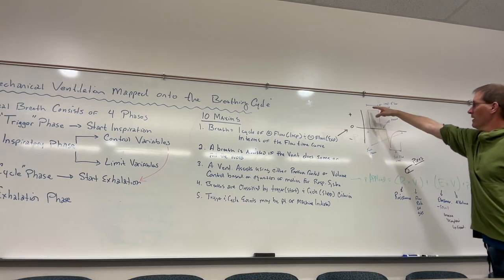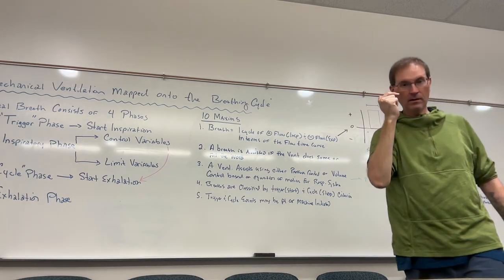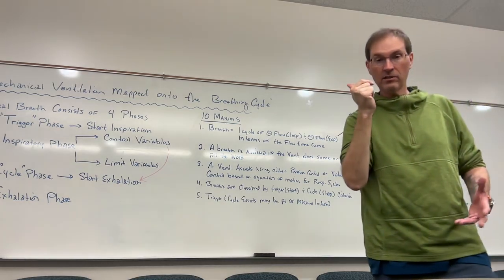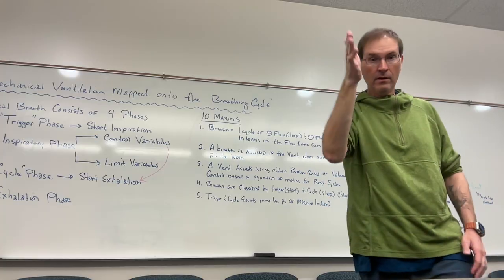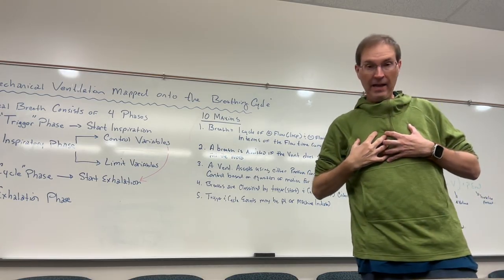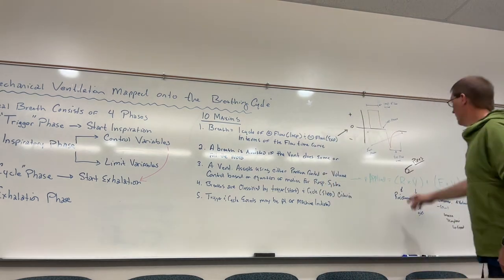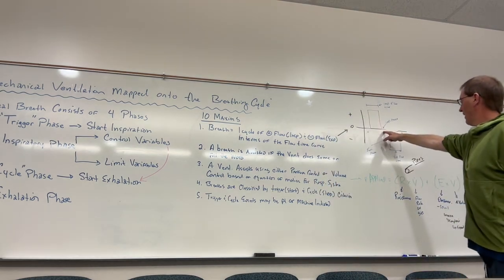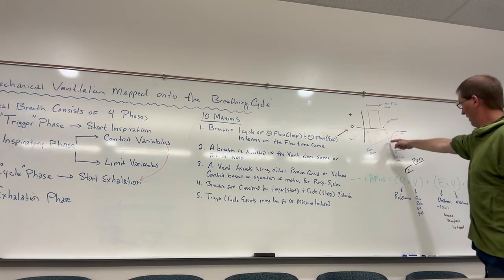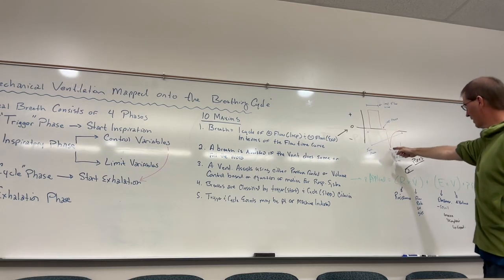Typically when you see a straight line, it's going to be the inspiratory flow, because the ventilator can basically instantly deliver a certain flow rate, whereas remember, even with mechanical ventilation, exhalation is primarily passive. And so you're not going to often have a straight line. You're going to have a curve as the airflow gradually increases over time.